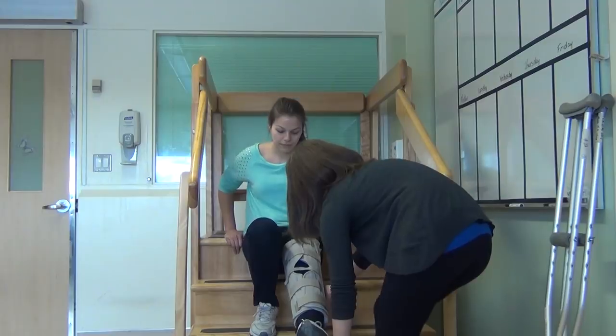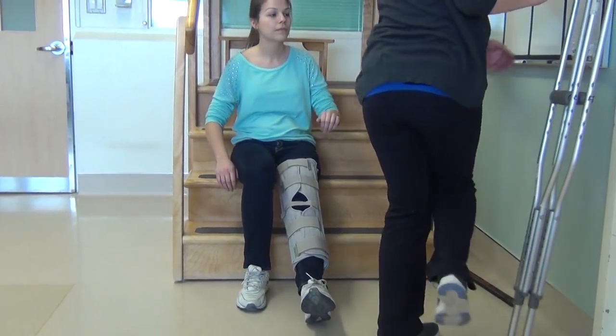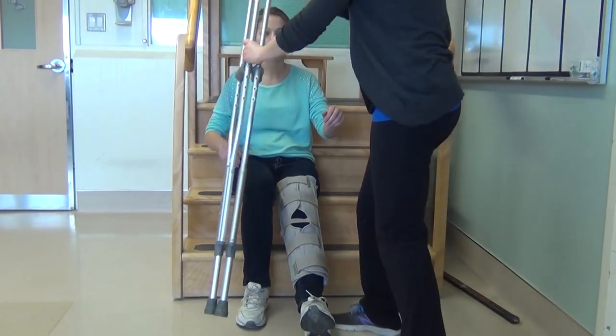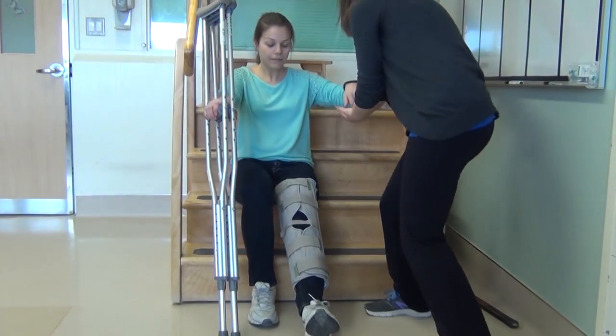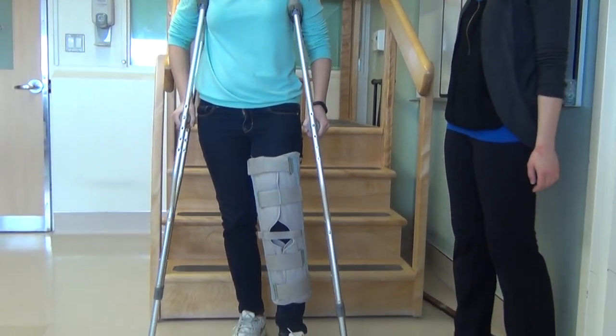Have an adult support your injured leg all the way down the stairs. Don't place any weight on your injured leg. Once your good foot reaches the bottom of the stairs, take your crutches in one hand, pushing down on the handles, and get an adult to help you stand up. You may then place your injured leg on the ground for balance.